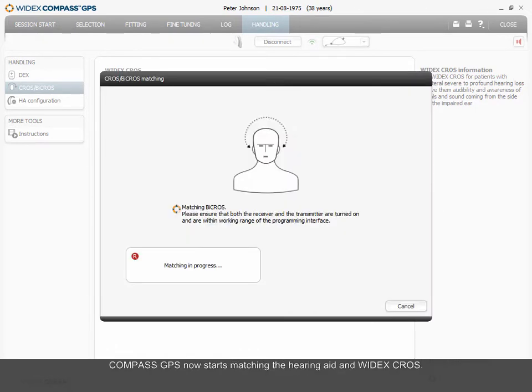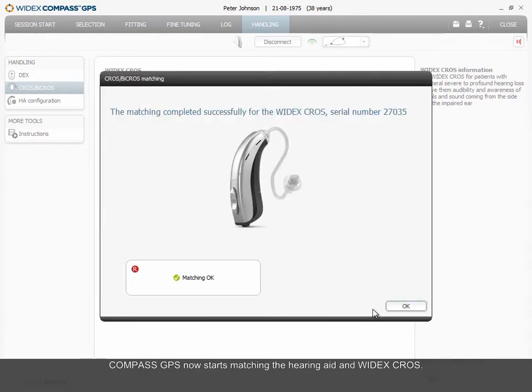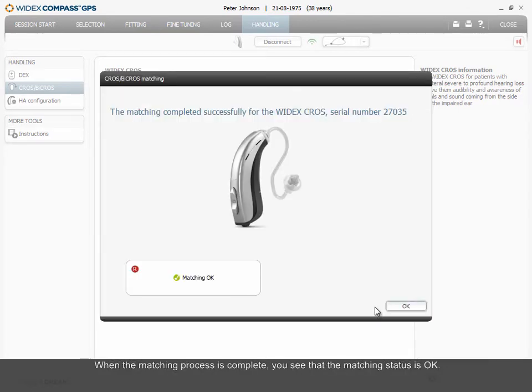Compass GPS now starts matching the hearing aid and Widex CROS. When the matching process is complete, you see that the matching status is OK.